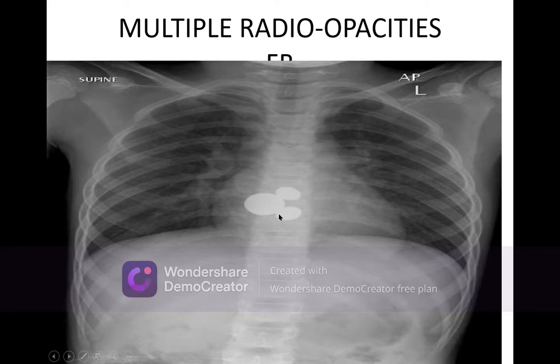Now, foreign body in the esophagus. Here is the gastroesophageal junction. This is the junction part. So here one has engulfed what we call coins. It is probably a psychiatric patient. Look at the geometry of the shape of these opacities.